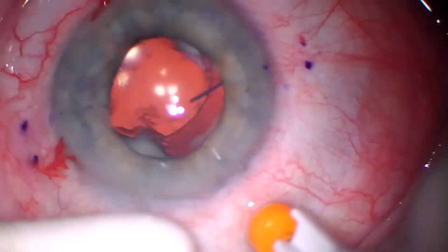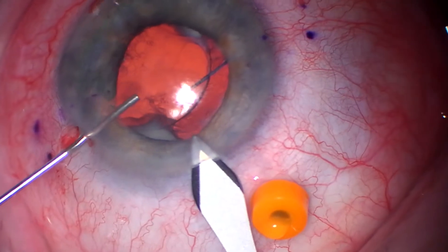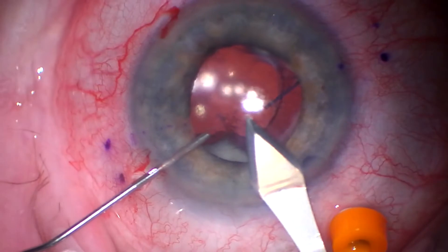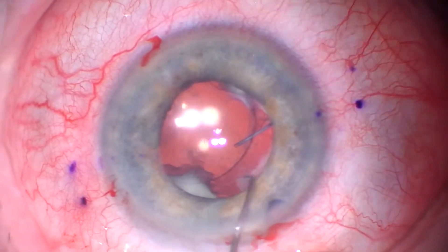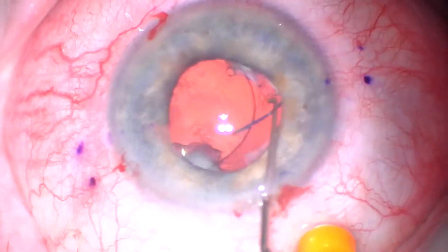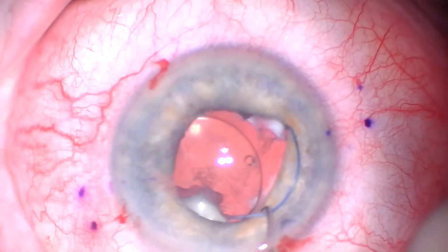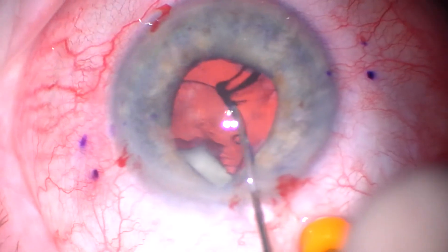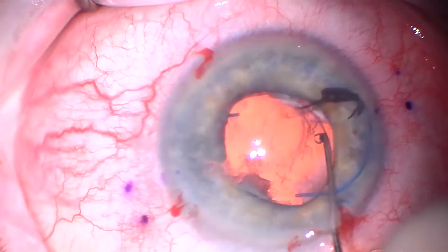You can see that lens in there is just kind of dislocated. There's significant Soemmerring's material, so much so that it's actually shoved the IOL up against the back of the iris, and there's significant TIDs. But I can tell that it's in the sulcus, so I'm just kind of dialing it out. There is some adherence to some iris material there, but it still ultimately came out easily.